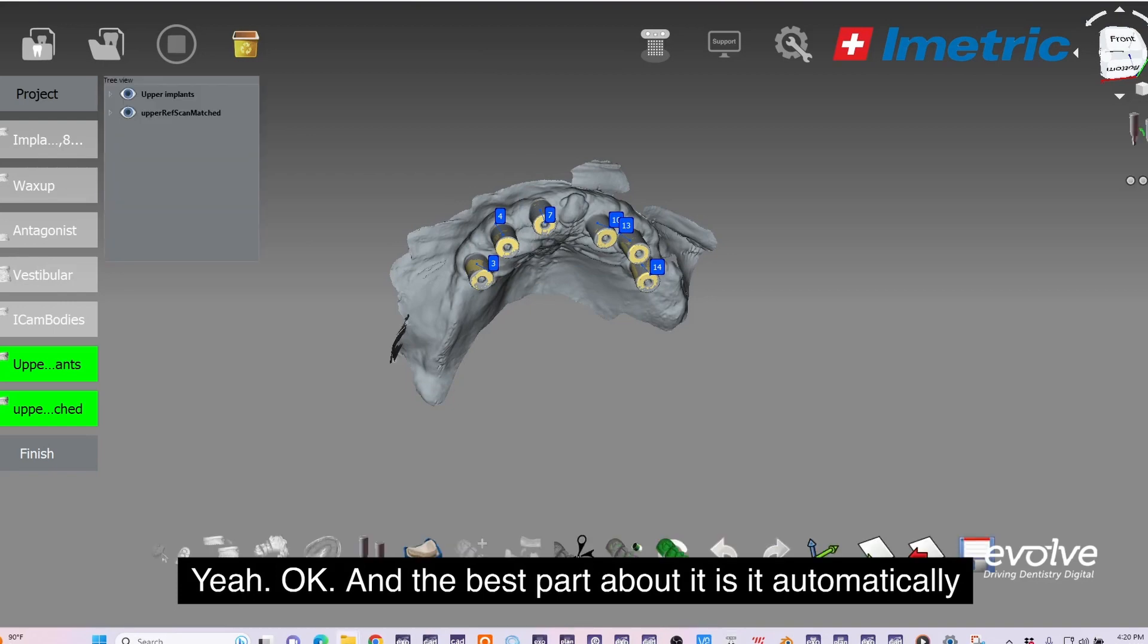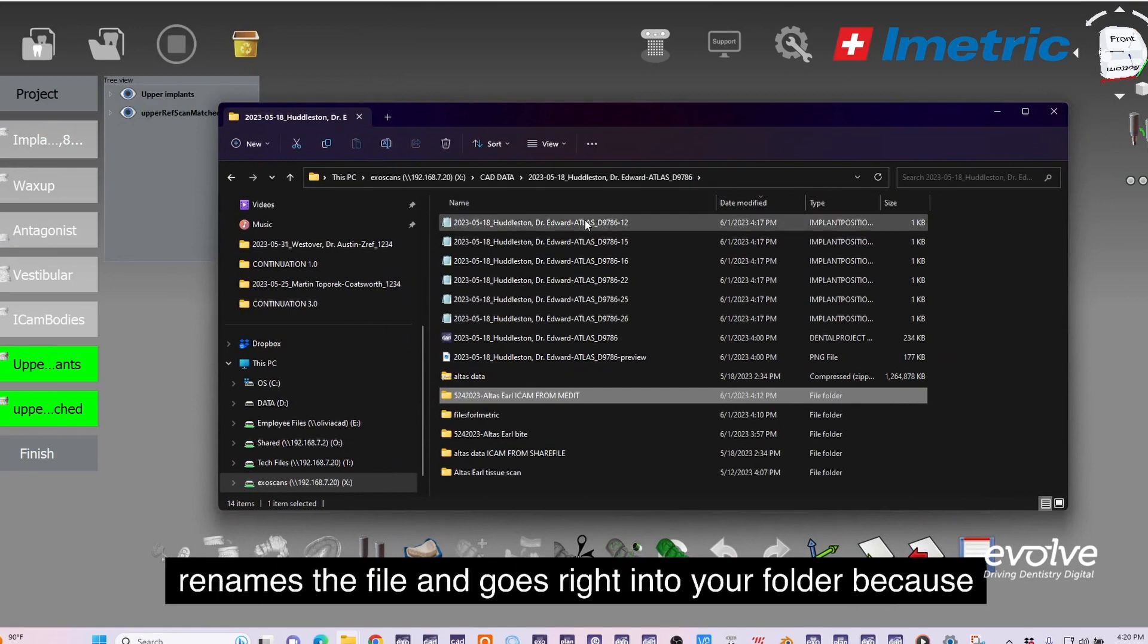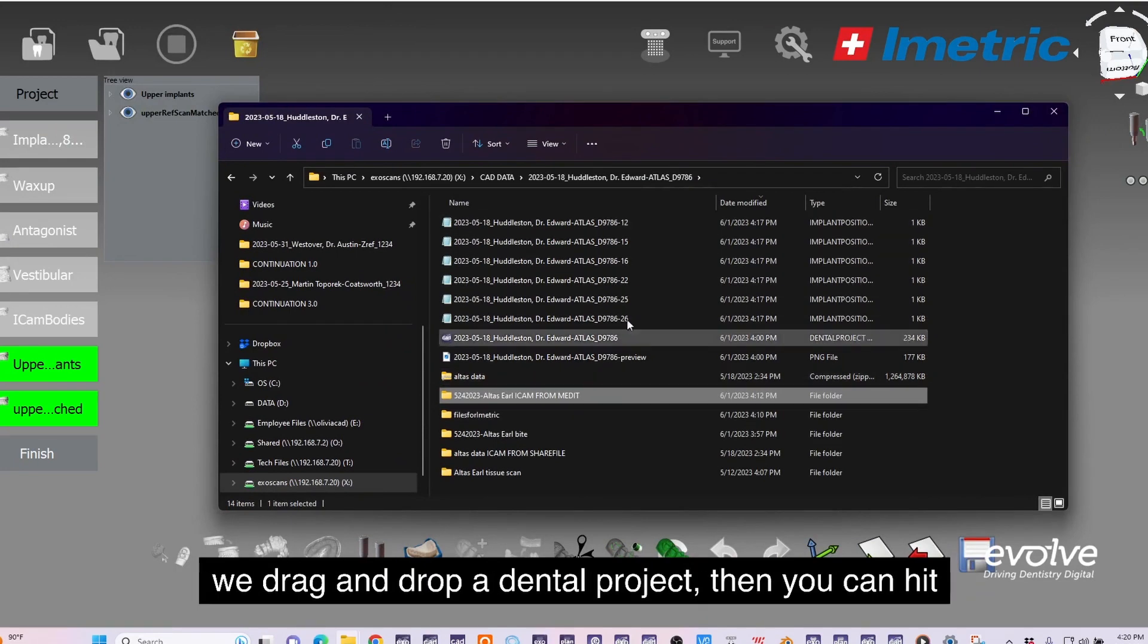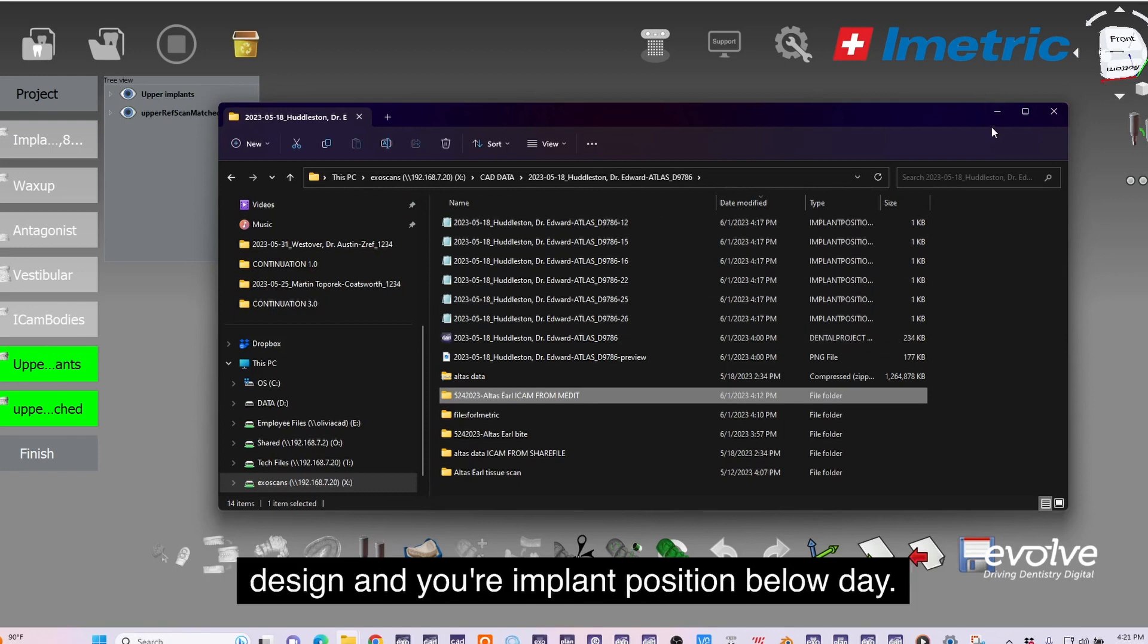The best part about it is it automatically renames the file and goes right into your folder because we drag and drop the dental project. You can hit design and your implant positions will load in.